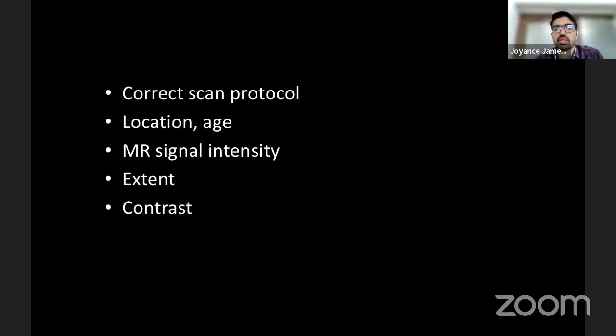Another question: when is a CT necessary after MRI, apart from suspected osteoid osteoma? So from practical experience, I would say anytime we have marrow edema which we are not able to explain, whether osteoid osteoma or not. When you have marrow STIR hyperintense signal which we are not able to explain, getting CT cuts always helps us in that situation. So many times, getting CT cuts in those cases always makes us wiser. It could be something like a stress fracture. It could be osteoid osteoma. Otherwise, some people take CT cuts in all the tumors, which may not be essential, because things like cortical destruction and erosion can be made out on MR well, and you have the radiograph to look for the matrix. If you do it, fine, but if you don't, also fine. But the important thing is, where on MR things are not clear, taking CT cuts always helps.